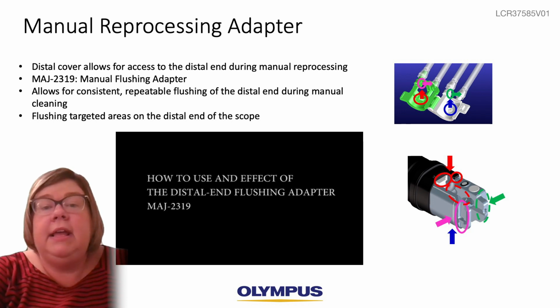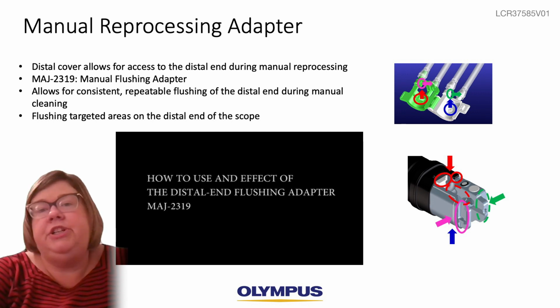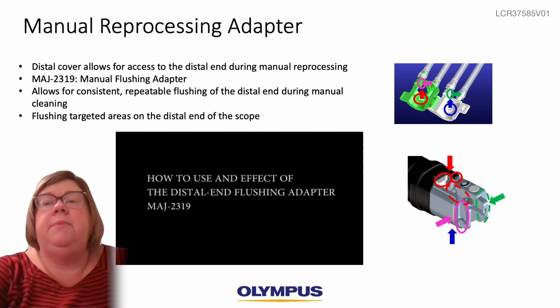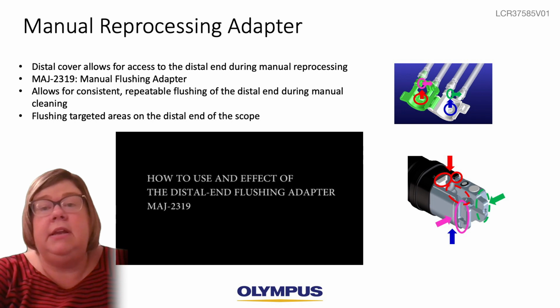on reprocessing, is the MAJ 2319, the manual flushing adapter. Because the TJF Q190V features the disposable distal cover, this allows the reprocessing technicians and nurses to have access to the distal end while reprocessing, as we can clearly see. With this access, Olympus has developed a flushing adapter that allows for consistent, repeatable flushing onto the directed areas on the distal end of the duodenoscope. I will play this video to give you an idea of how the adapter works.